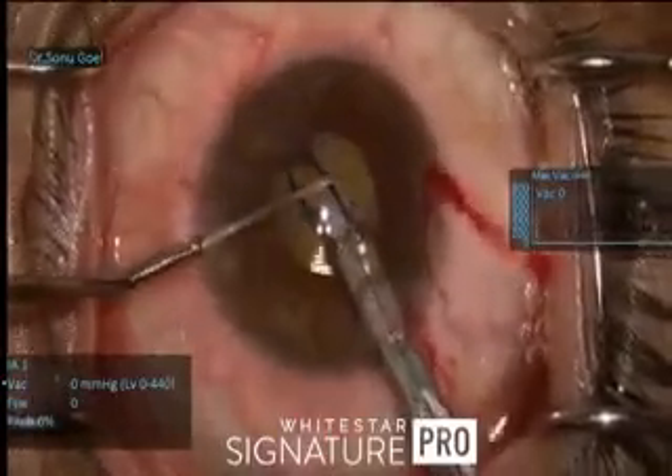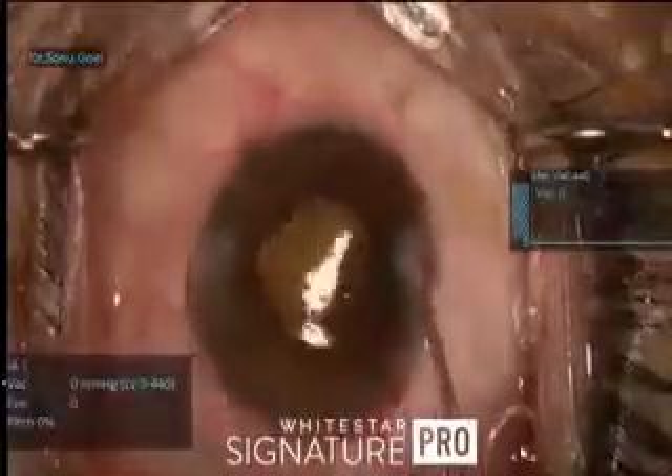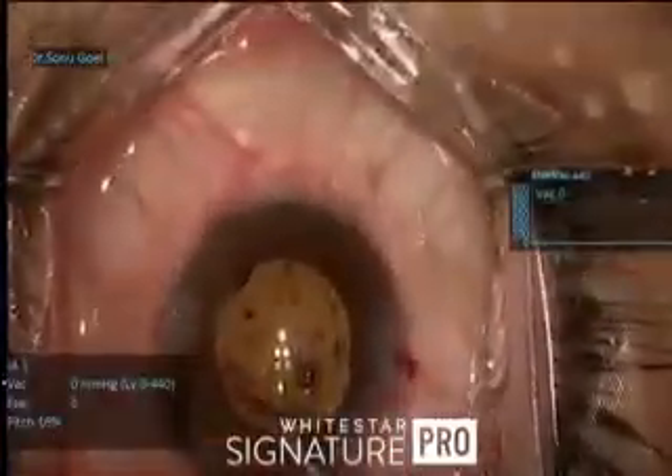This is how the final picture looks — the wound is hydrated and the viscoelastic is washed out.